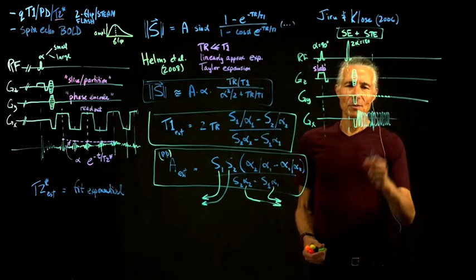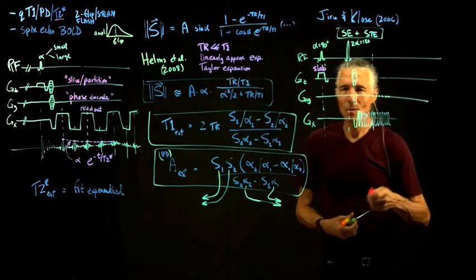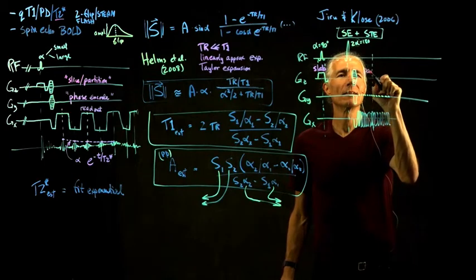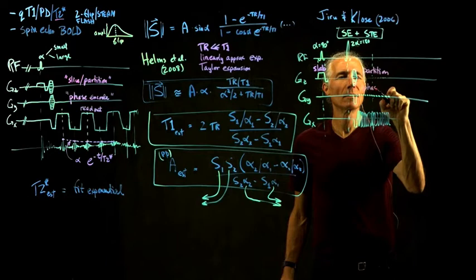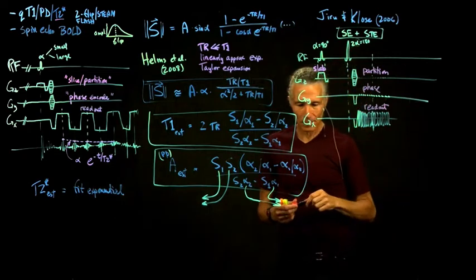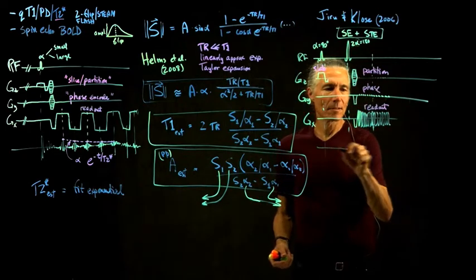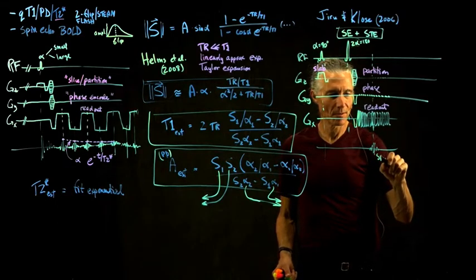So that's all. What I drew so far was a spin echo EPI. So this is partition, and this guy is phase encode, and this is readout. So the echo we get here, this guy down here, is going to be a spin echo.